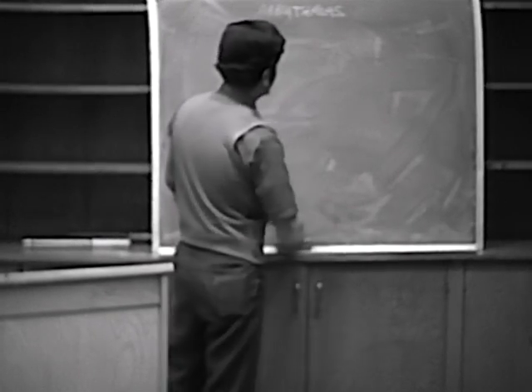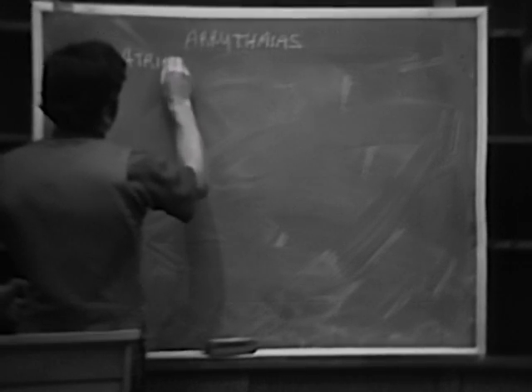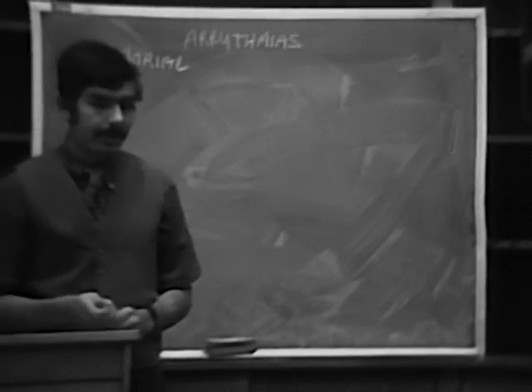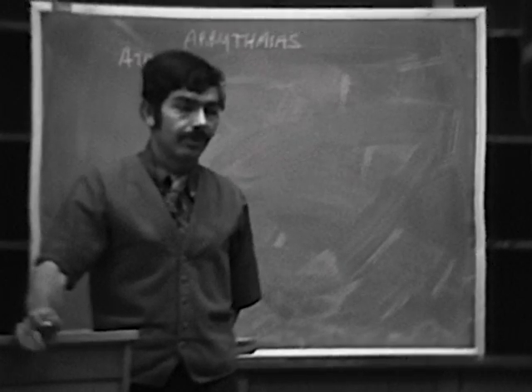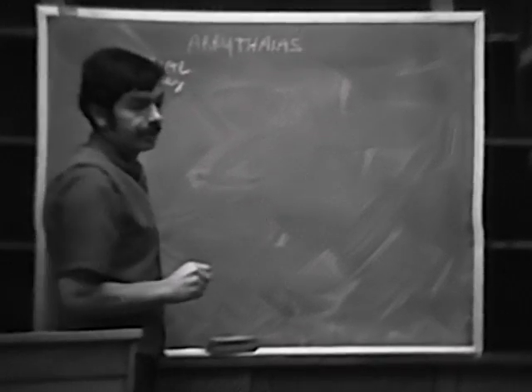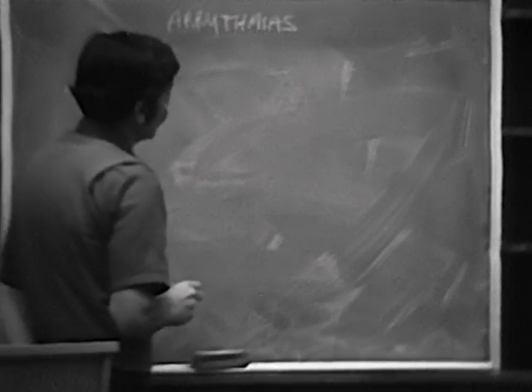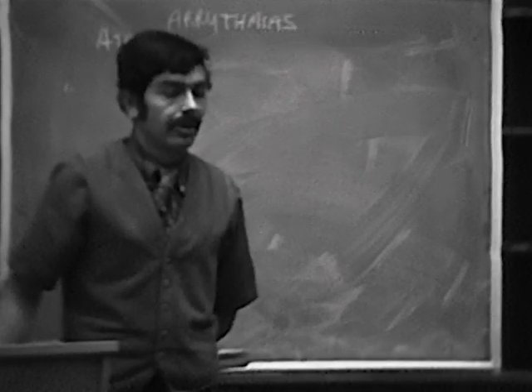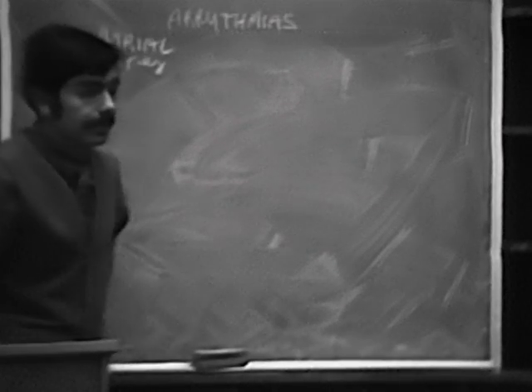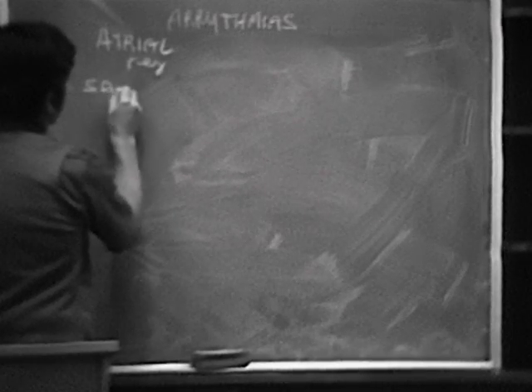we'll go on, and we'll first talk about the atrial arrhythmias. And we'll divide the atrial arrhythmias into those that appear regular and those that appear irregular. Well, first we'll talk about the regular atrial arrhythmias. And then we'll start out with the slowest and then speed up. So what's the slowest atrial rhythm? What do we call it? Pardon? Bradycardia, sinus bradycardia, right. Sinus bradycardia.